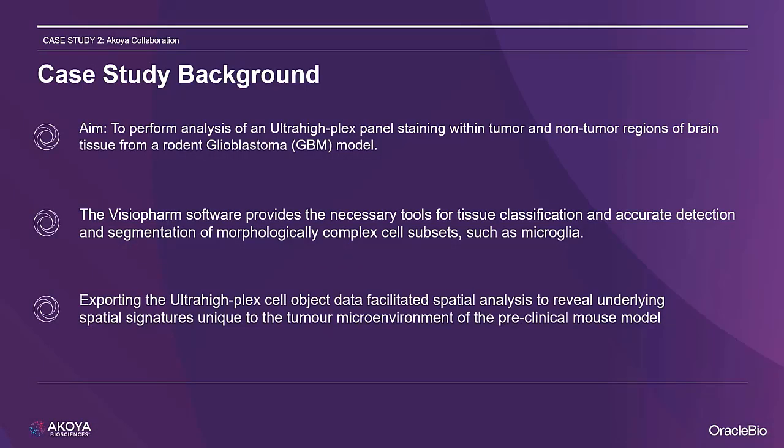For this collaboration, we aimed to showcase the capabilities of the Visiopharm software using ultra-high-plex stained images. We approached this by developing multiple algorithms on Visiopharm to enable us to classify the tissue, to segment and then phenotype morphologically diverse cell subtypes, and also to perform area quantification of certain markers.